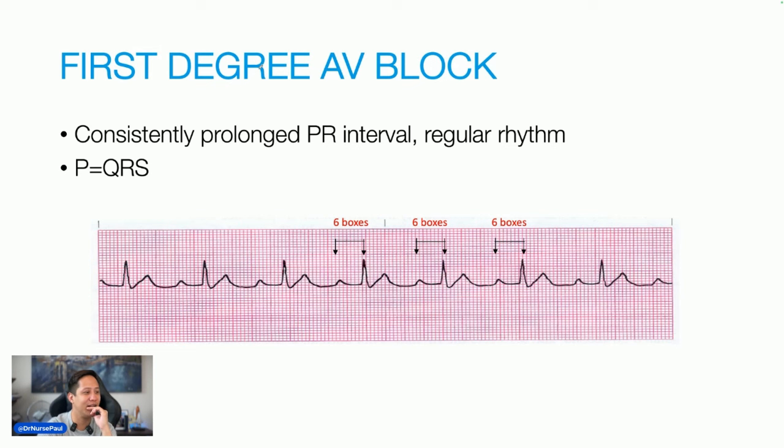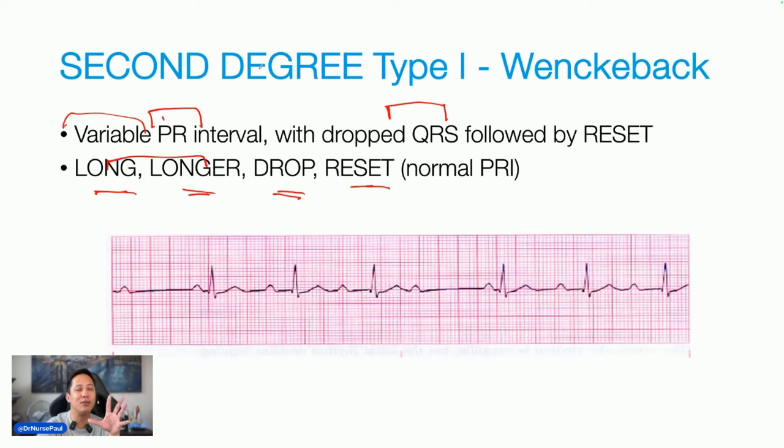Very good, nurses. Very good. You can review this video, okay? Second degree type 1, what's our pattern? Long, longer, drop, reset. Long, longer, drop, reset. It gets longer and longer and drops, and then resets.